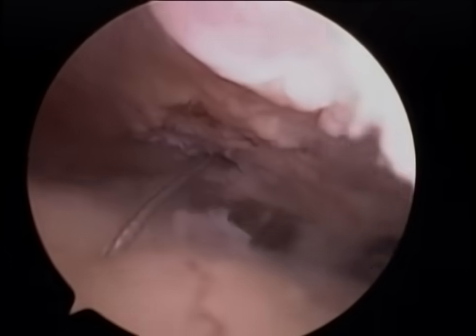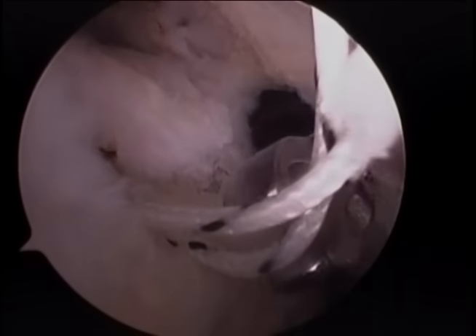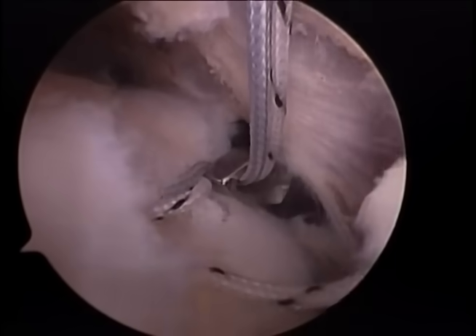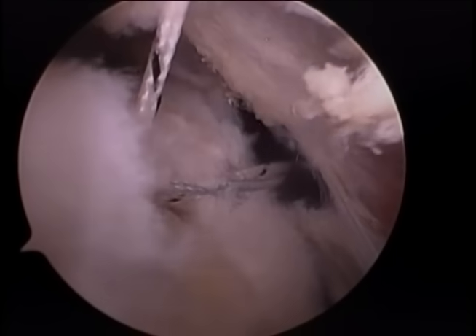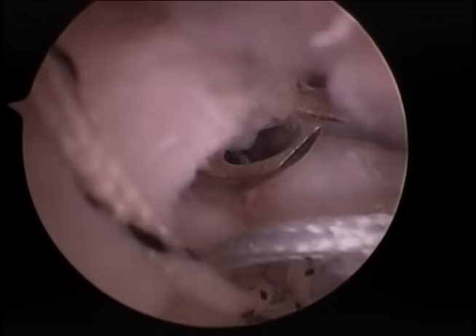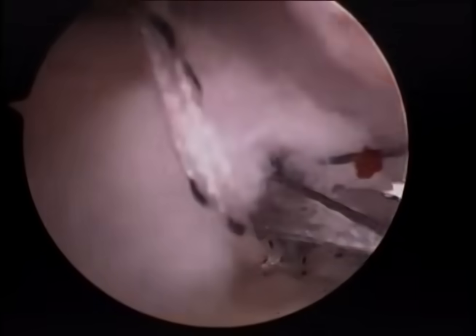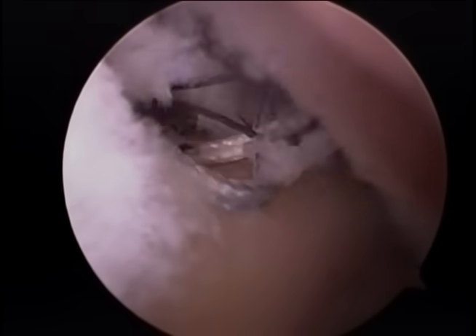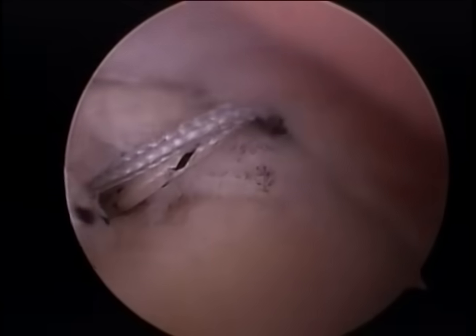you see here. We again use our retriever to take a blue and a white suture out our anterior cannula again. We repeat the same step with our suture lasso, holding onto the edge of the tendon for tension. We pierce the tendon medial to the tear, produce our lasso, and again we retrieve this lasso loop out our cannula. We shuttle our two sutures through the tendon.